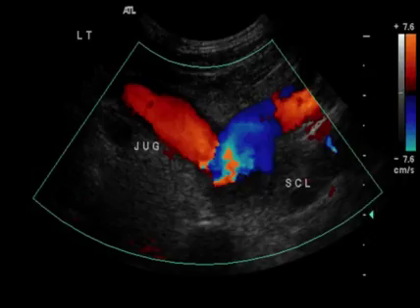This is an interesting piece of physiology which tells us a lot. If you look at the color pattern on this particular patient, you can see that the subclavian vein is displayed in blue in that it's going away from the transducer, but the jugular vein is displayed in red going up toward the patient's neck. So in this particular case, with or without abnormal spectral lack of phasicity, by the physiology here, you can clearly see that the innominate vein on the left is out, probably chronically thrombosed or scarred, and that flow comes down through the subclavian vein and then reverses its course going up into the jugular vein.